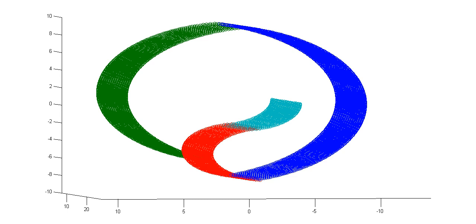And that's what's being measured, and different tissues will have different properties about how they get knocked out of alignment and fall back into alignment. The main thing is you basically get a grayscale image of the tissue, because different tissue has more or fewer water molecules. So bone is one color and soft tissue is a different color. And so you basically get an image of the soft tissue of the body.